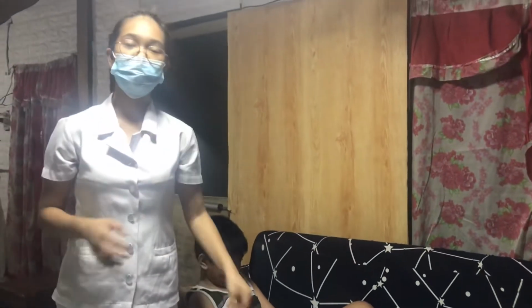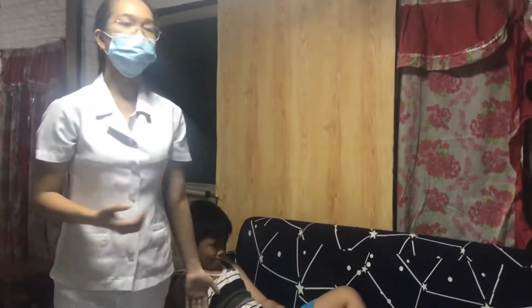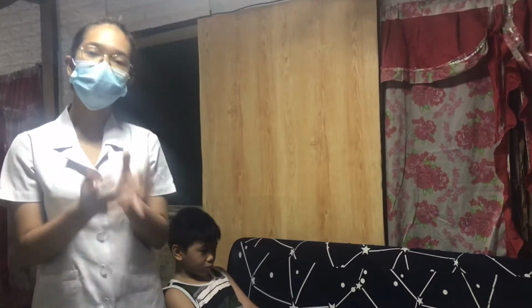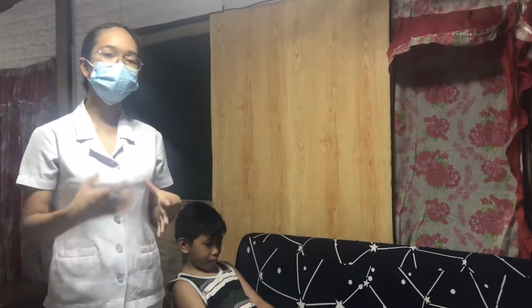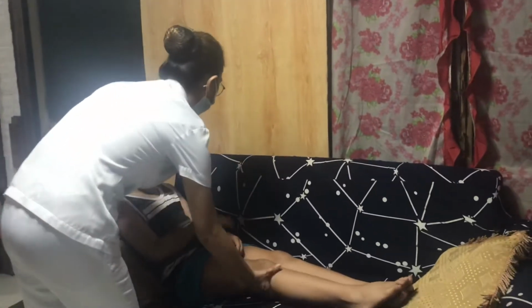As I can see, there's no tenderness on this injection site, and when I inspect this vastus lateralis, there's no inflammation, bruises, or any edema, so it's good for an injection site. So after palpating and inspecting the part where you will be administering the injection, place the client in a comfortable position so that we'll be able to execute the administration of the medication properly. So anyway, sir, can you lay down for me, please?